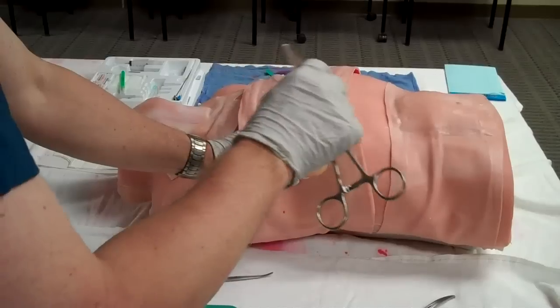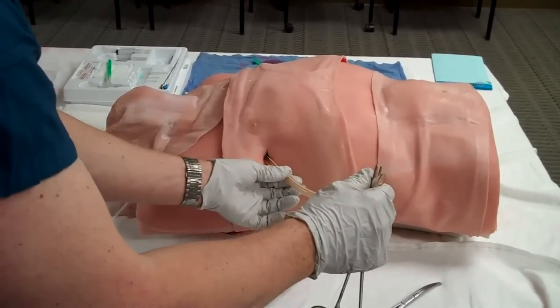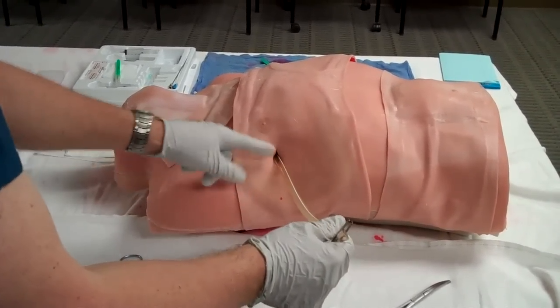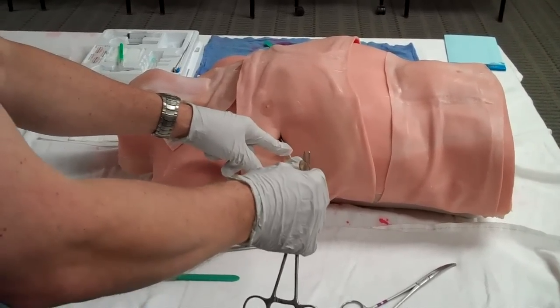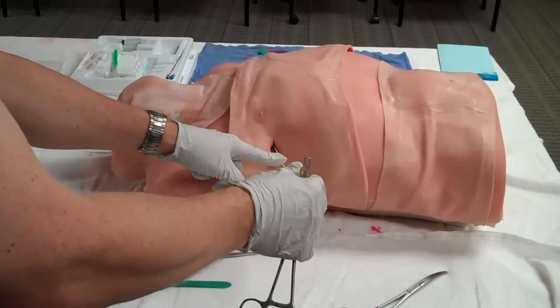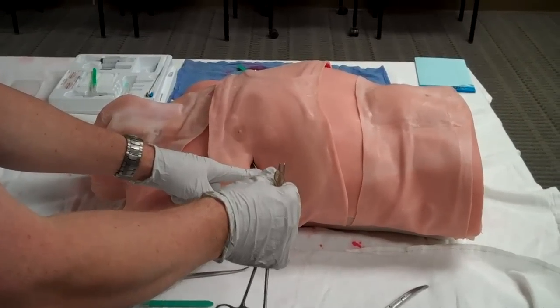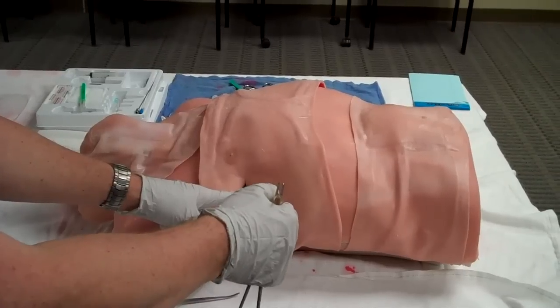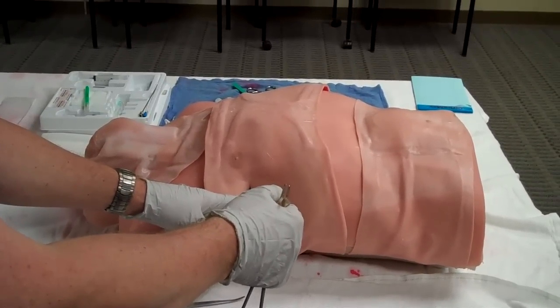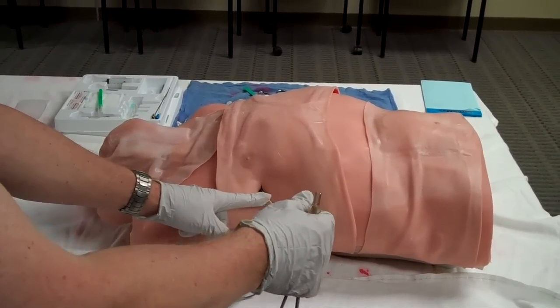So now, once I've got it kind of where it's going, I want to insert it so that the very last hole on the tube is inside the chest. I saw it go in, and there are generally markings on the chest tube that will tell you how deep it is. In most people with a normal body habitus, you'd like to see the 12 centimeter mark at the skin. If somebody is morbidly obese, they may need to have a higher number, 16, 18, occasionally 20, to make sure that last hole is within the pleural space.